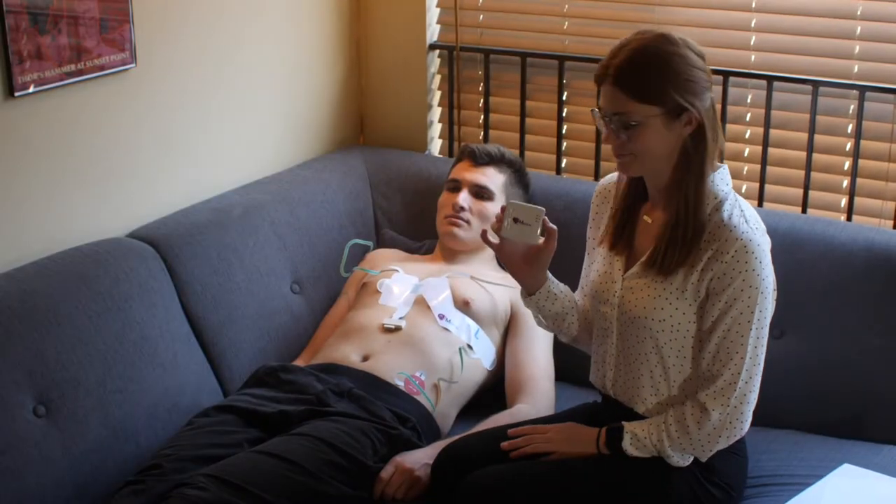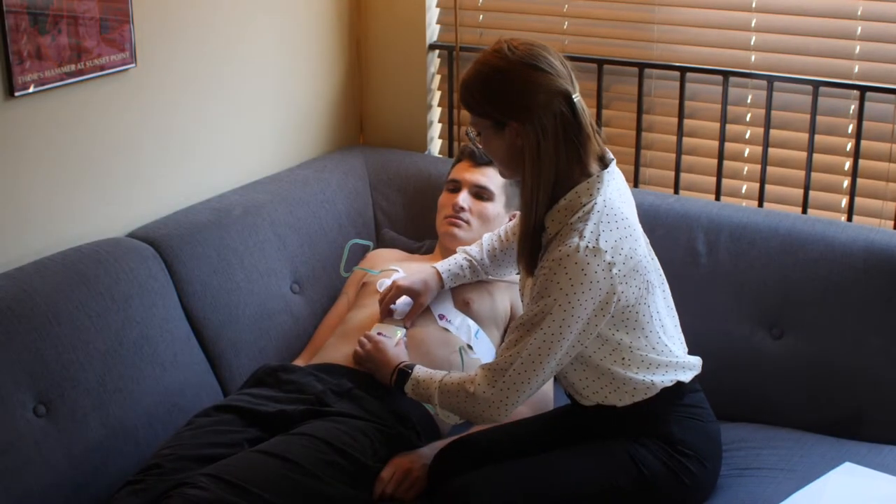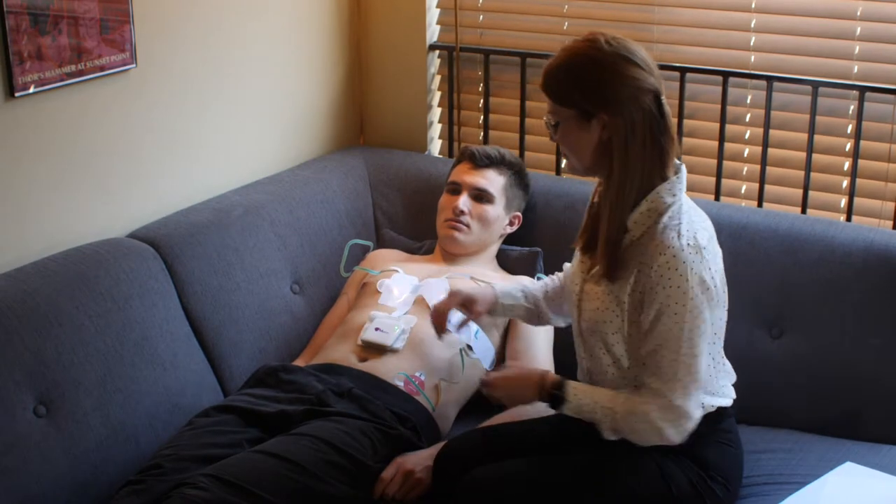Next, hold the power button on the recorder for 5 seconds until the lights come on. Connect the recorder to the strip by snapping it in. Place a piece of gauze or tissue between the device and the skin.